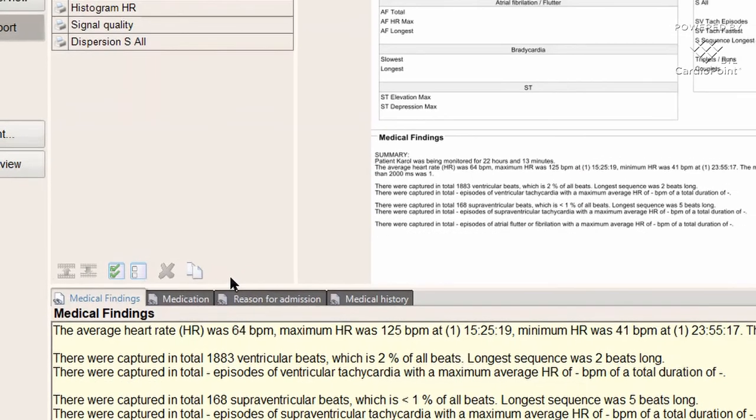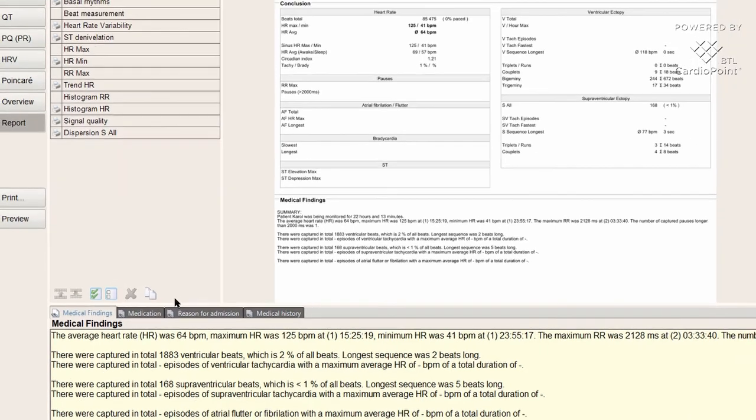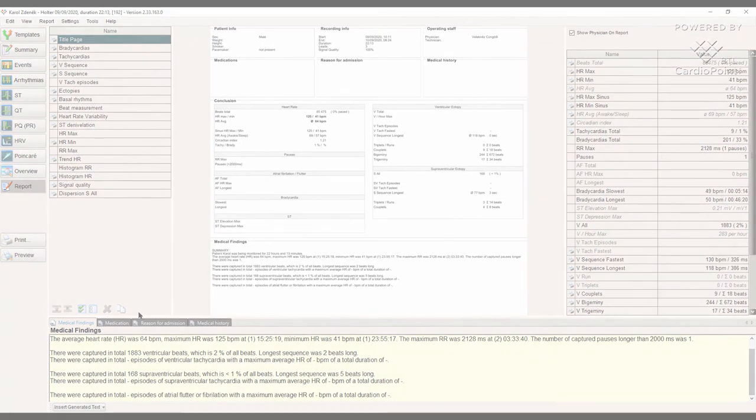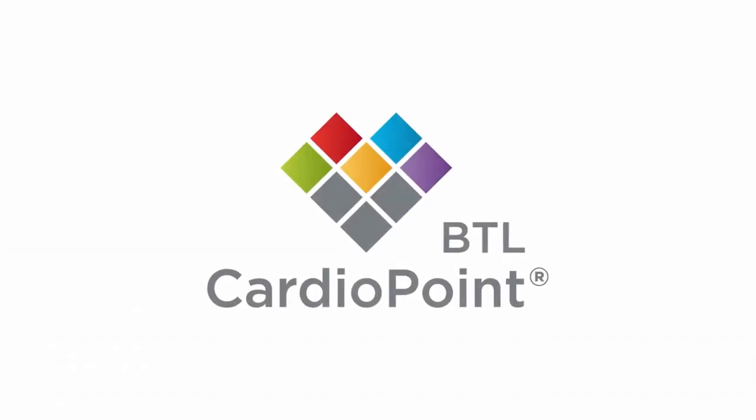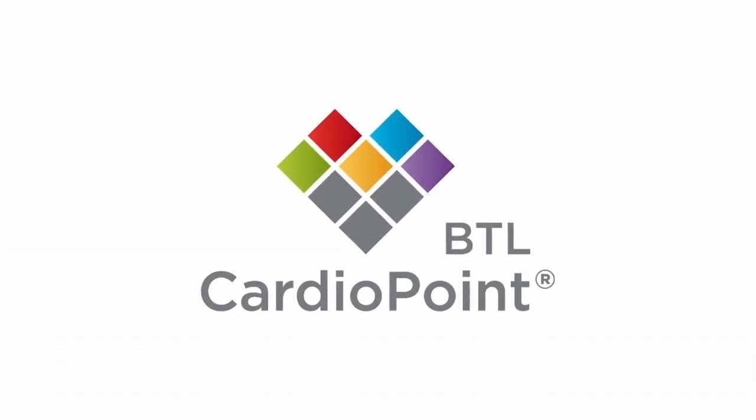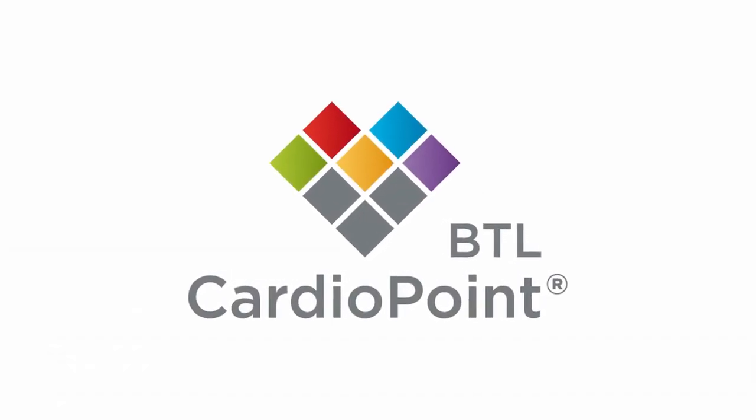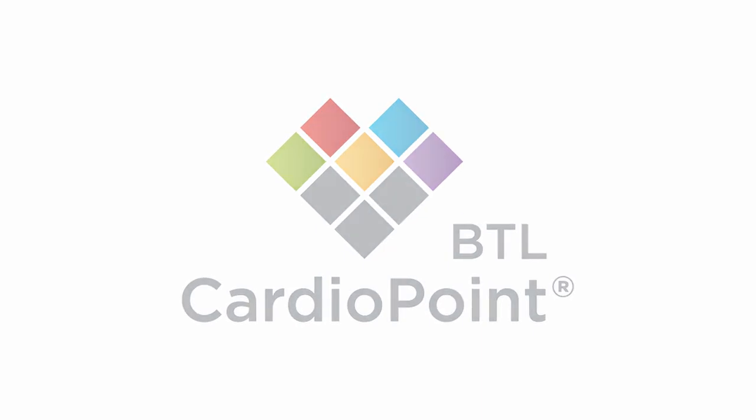With this last function, we have covered all the basic steps in the 24 hours Holter ECG analysis. Thank you for your attention and enjoy your work with BTL Cardio Point Holter.